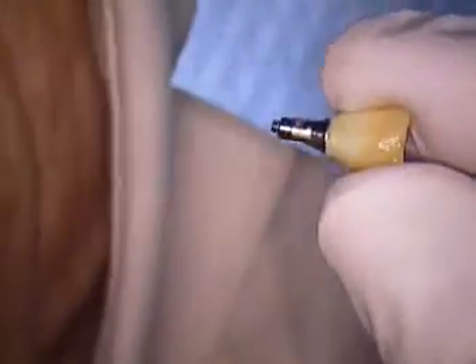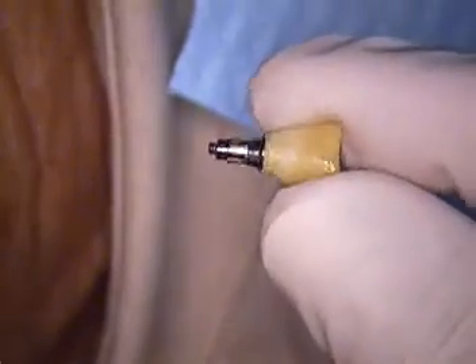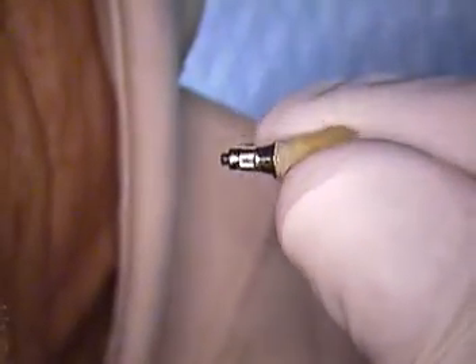It is of the Straumann type. Right now I'm going to remove his temporary screw-retained crown. Some of the original design that was done from the surgeon, we'll put that away.